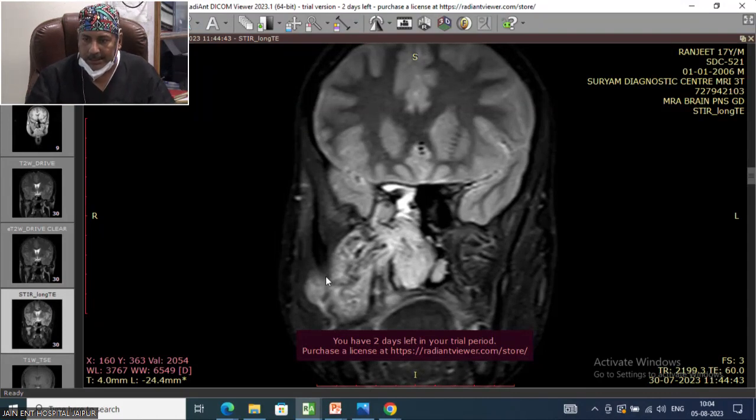We will never advocate entering inside the tumor unless you take adequate vascular control. Never enter inside the tumor unless you expose from all around. I'll show you how to expose anteriorly, anterolaterally, posteriorly, medially, superiorly, everywhere, and then finally go on to the tumor. So in this entire surgery, 90% of the time will be spent or invested in exposure and vascular control, and then finally we'll get on to the tumor. This is the primary principle we are going to follow.